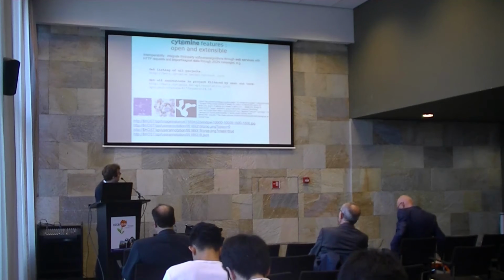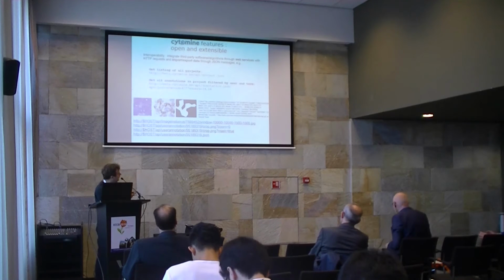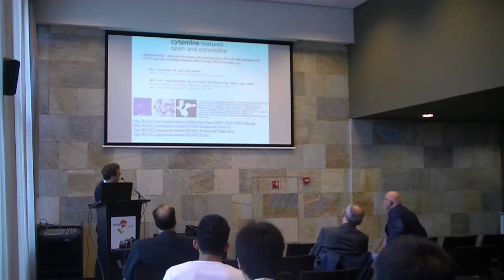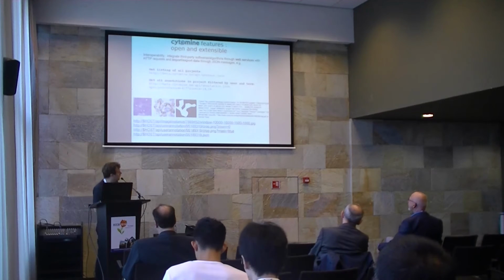And here you have examples. It's easy to export an image area. You ask for the image area from these coordinates and of this size, and you get this type of result. So you can really export images, annotations and annotation masks using the web services.